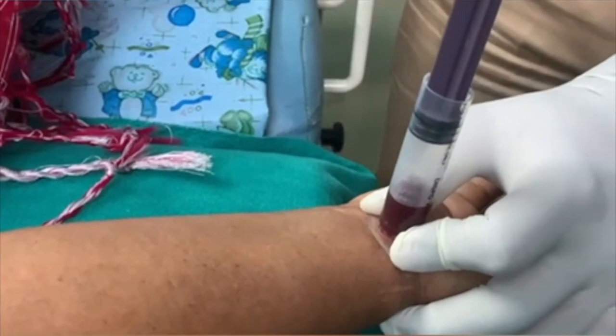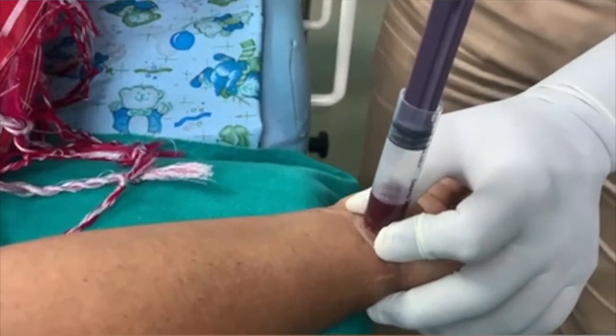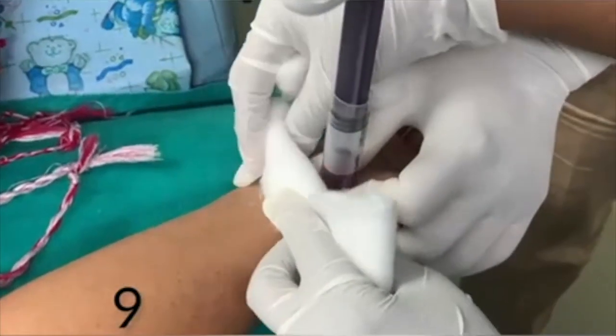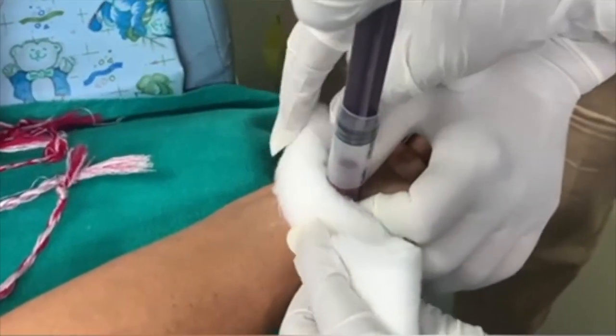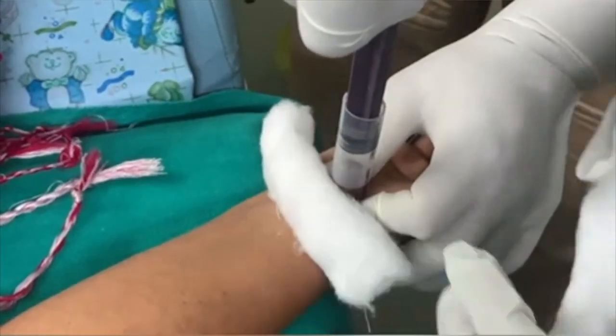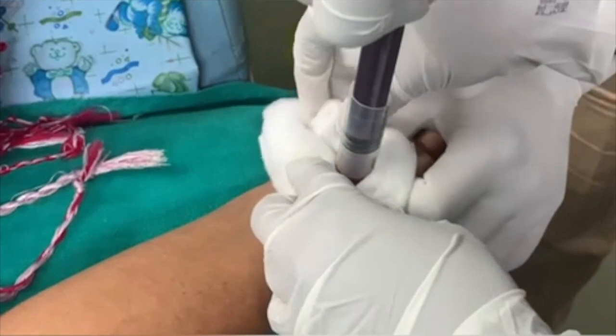The column of blood is coming up. After 10 minutes, we can remove the suction by keeping cotton over both sides. We can remove the suction, then we can wipe out the blood.